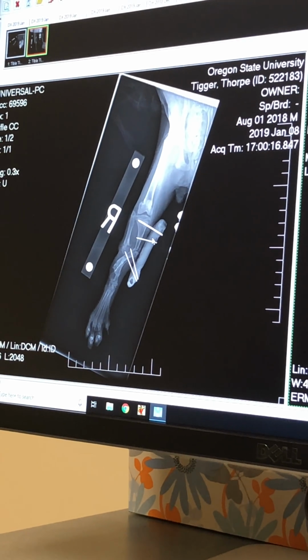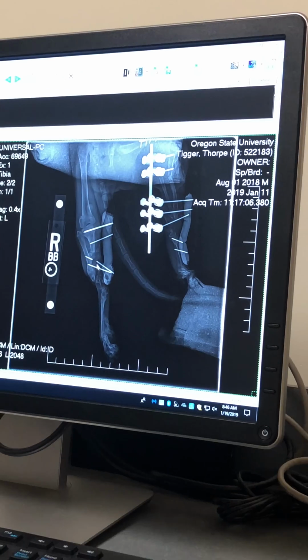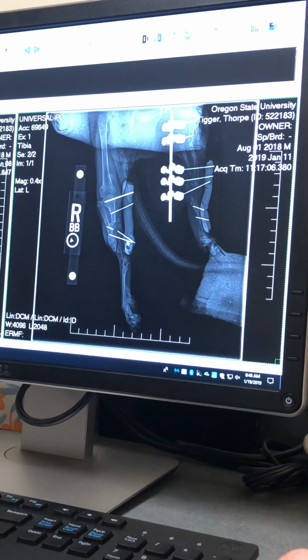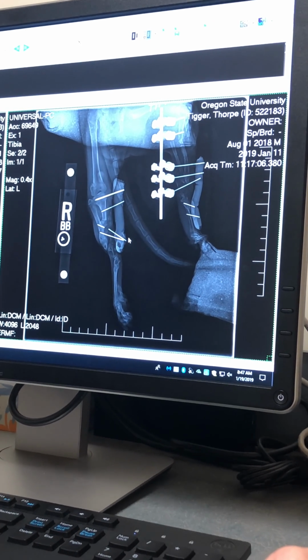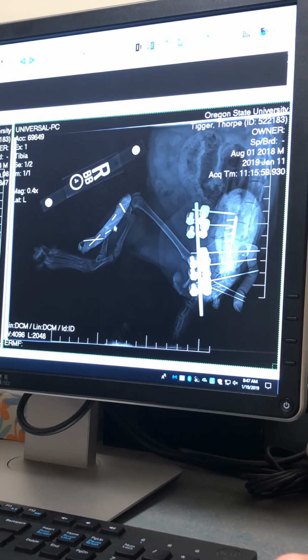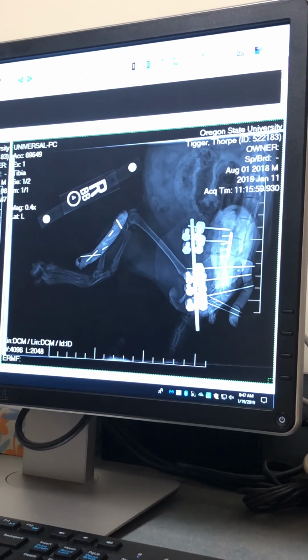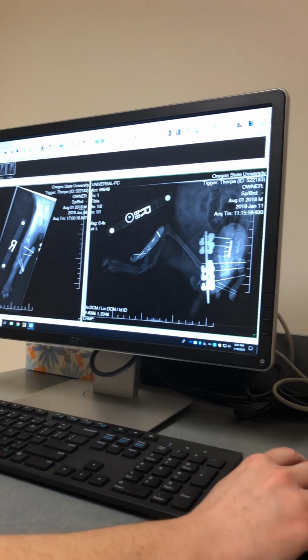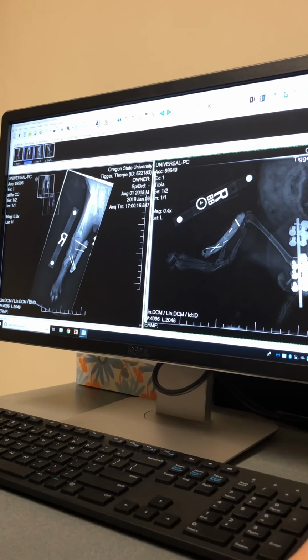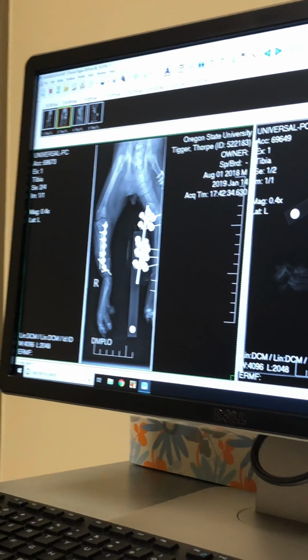Then the day that we were going to send him home, on the other side, it was abnormally moving, and what we could see is that he broke one of the pins here on that leg. And the other pin had backed out, and so we knew that it wasn't right, and when we pull up the same x-ray from a different version, the bones were not in the right place anymore. So then we went back to surgery, and instead of the pins, we put in a plate with a pin.